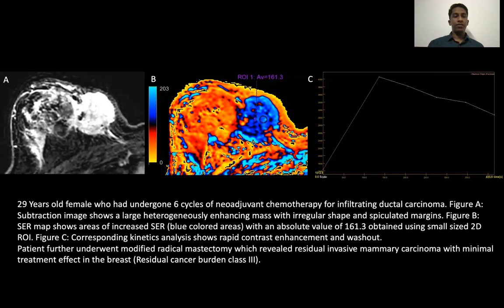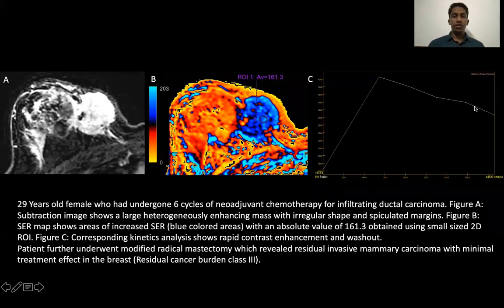Case 1: A 29-year-old female who had undergone six cycles of neoadjuvant chemotherapy for infiltrating ductal carcinoma. The subtraction image shows a large heterogeneously enhancing mass lesion with irregular shape and spiculated margins. The corresponding SER map shows areas of high SER indicated by regions colored in blue. A small 2D ROI revealed a high SER value of 161, and the corresponding kinetic analysis revealed washout kinetics. The patient underwent modified radical mastectomy, which revealed residual invasive mammary carcinoma with minimal treatment effect.